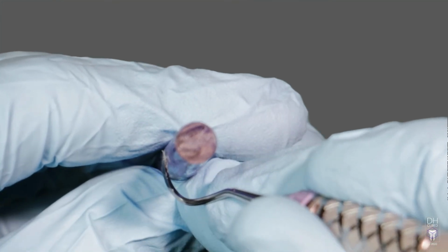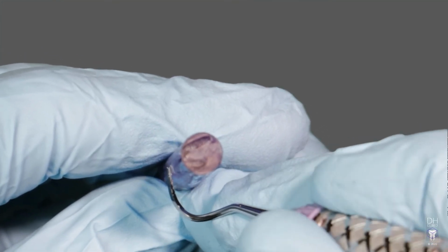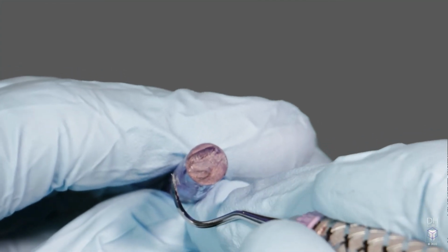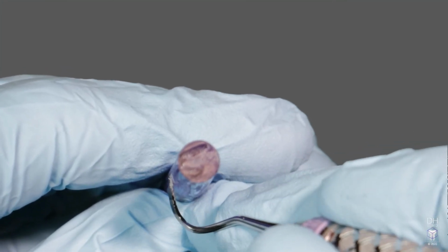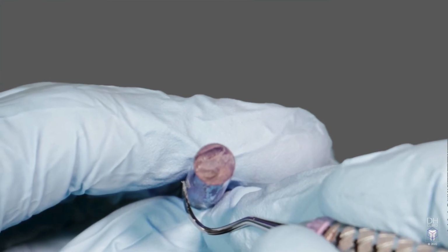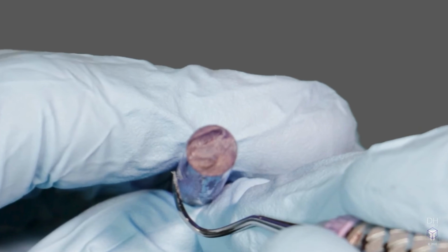If you have to press hard on the test stick, you will have to push hard on the patient's tooth. This can cause hand fatigue and possibly hand injury, and the patient will experience a heavy-handed hygienist. A sharp instrument that shaves the test stick using very little pressure will shave the calculus off of the tooth with very little pressure. Therefore, you will be working more effectively and be reducing your fatigue.